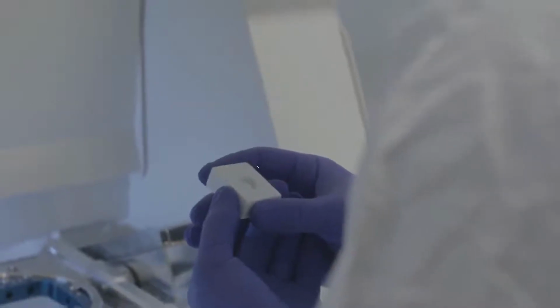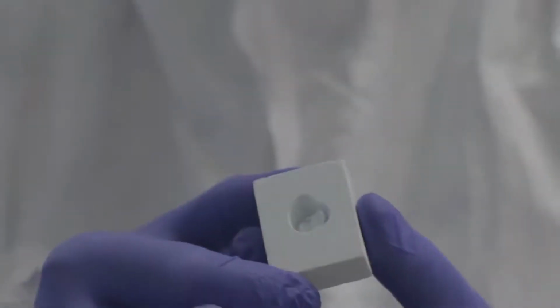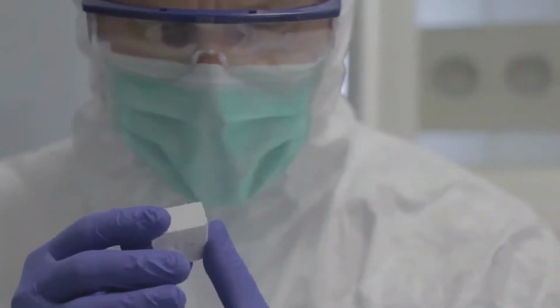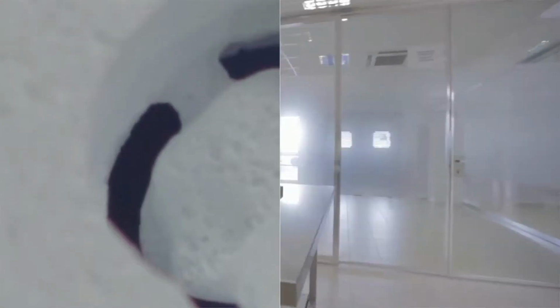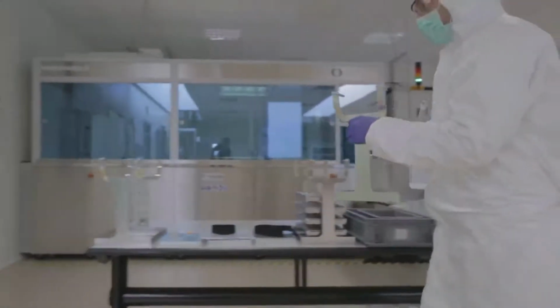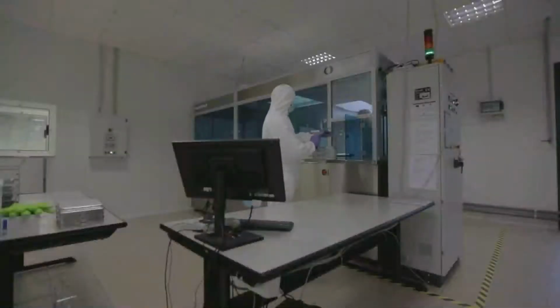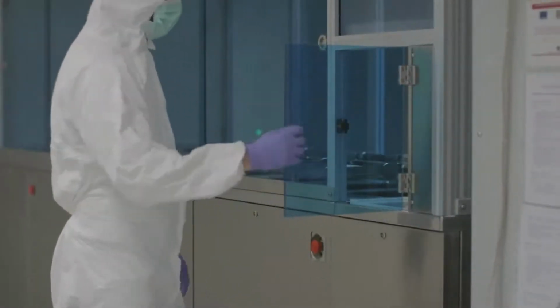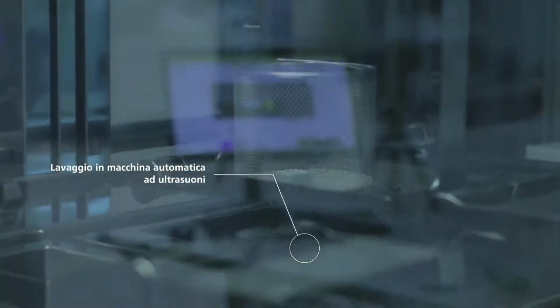The replica is very useful during the surgery to try the adaptation, to try handling and adapting the soft tissues, but also for the preparation of the hole for the fixation screw. All these aspects are key, very important, and they are made through the replica. So there's a set of things you will receive from the company, and then you can proceed with the surgery. I will show you later how fast and effective this workflow is.